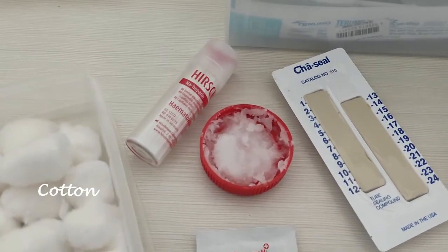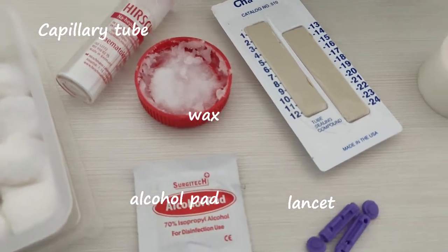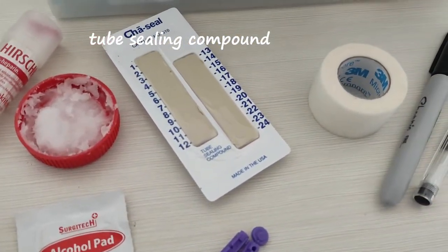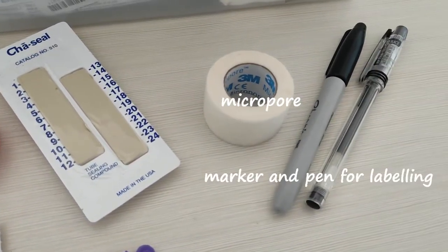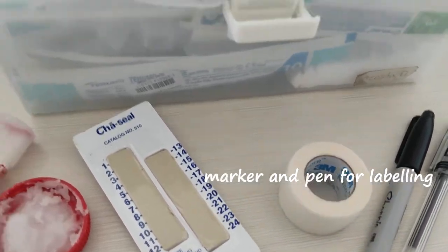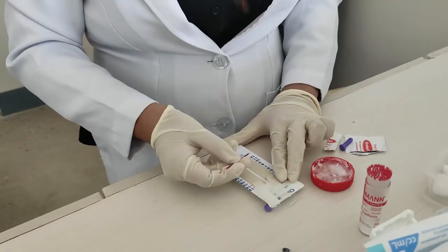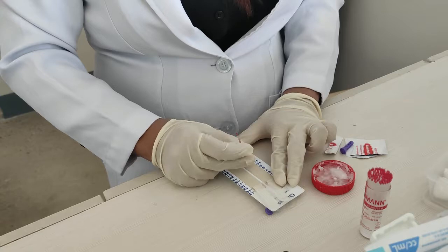First, we have to prepare the materials flashed on your screen. Collect an ample blood using a capillary puncture, filling up two-thirds of your capillary tube. Seal the tube using the tube sealing compound and wax.